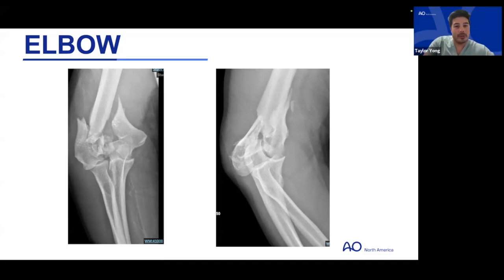Yeah, I mean, I'm a little bit spoiled by the imaging platform we utilize, and I'm probably more reliant than I should be on 3D reformatting because I think that it's just so incredibly useful. But in general, I don't ask for anything specific for the reformats. As long as they have a CT scan here, I can just press Control T and then I get 3D images, and that's been super helpful. So I'm spoiled in that way.